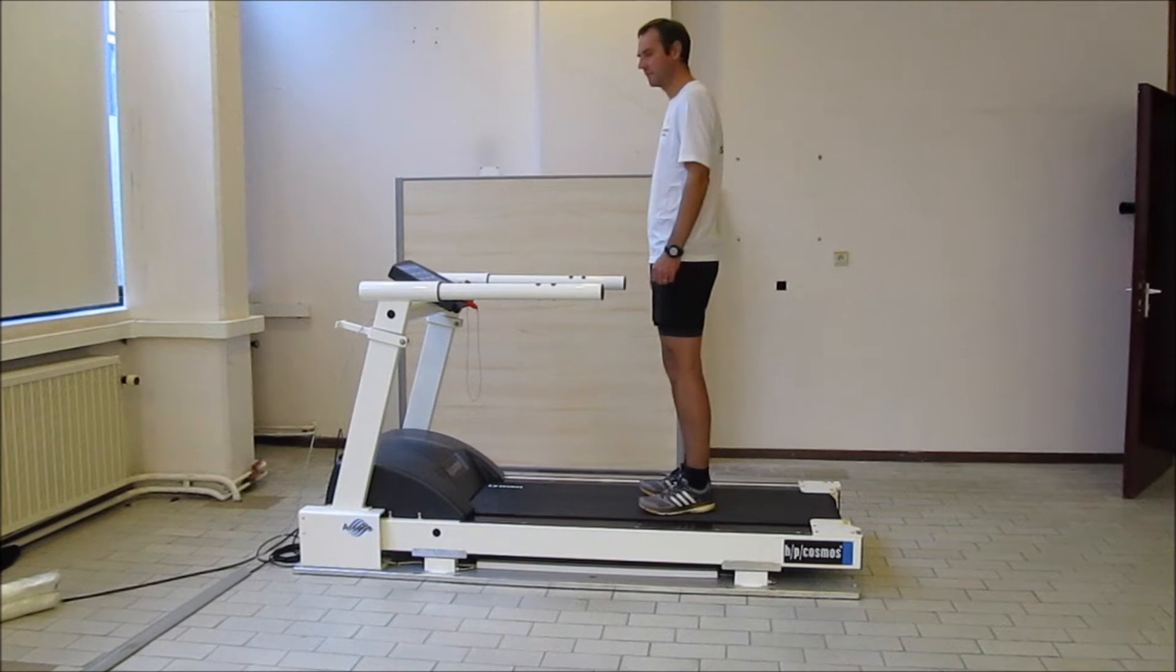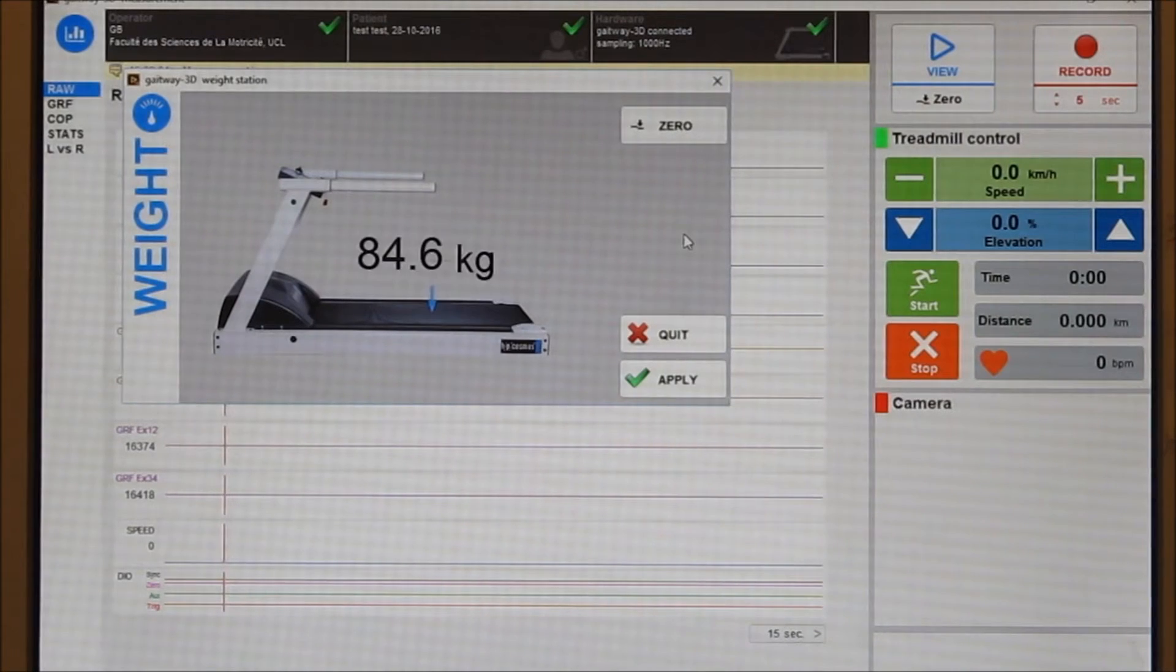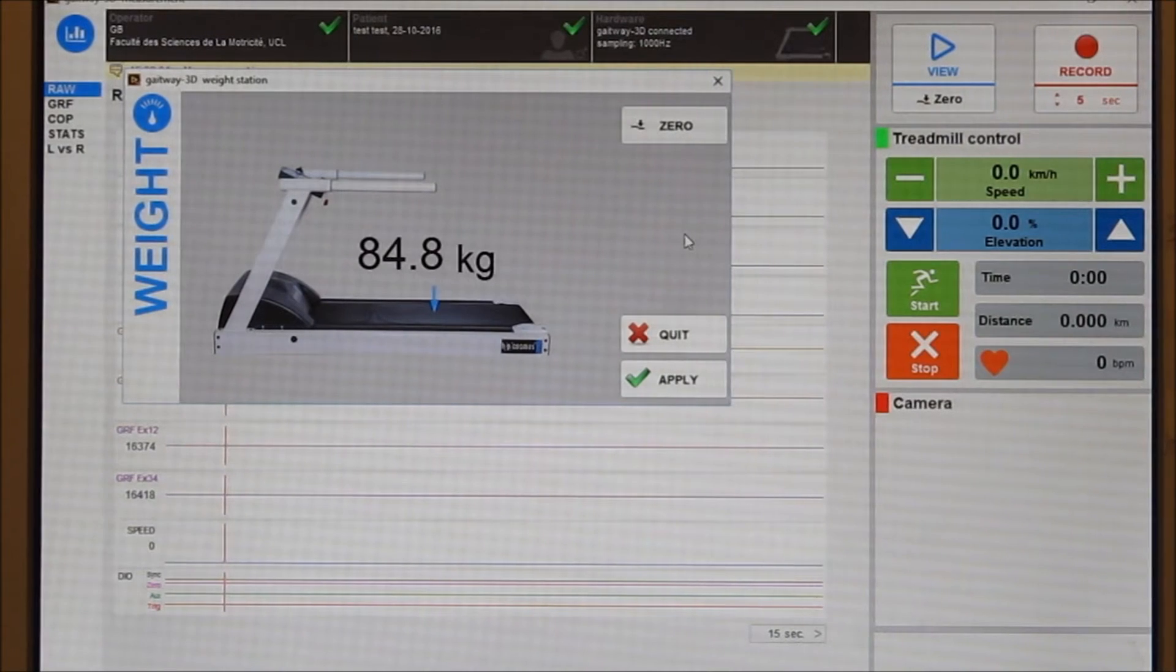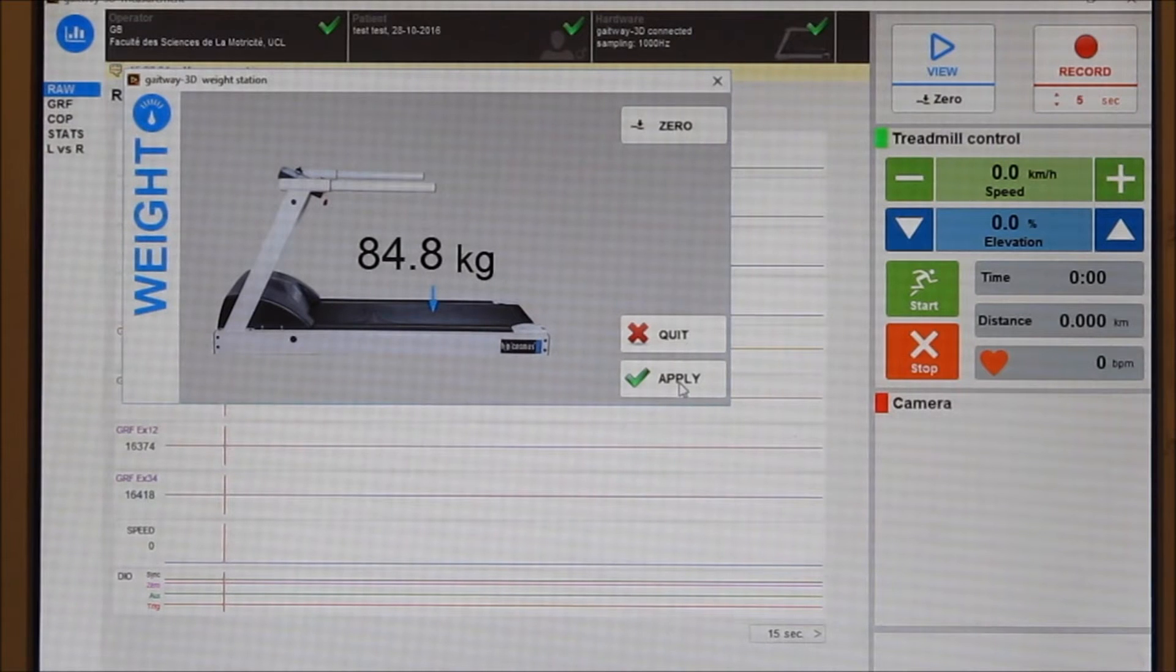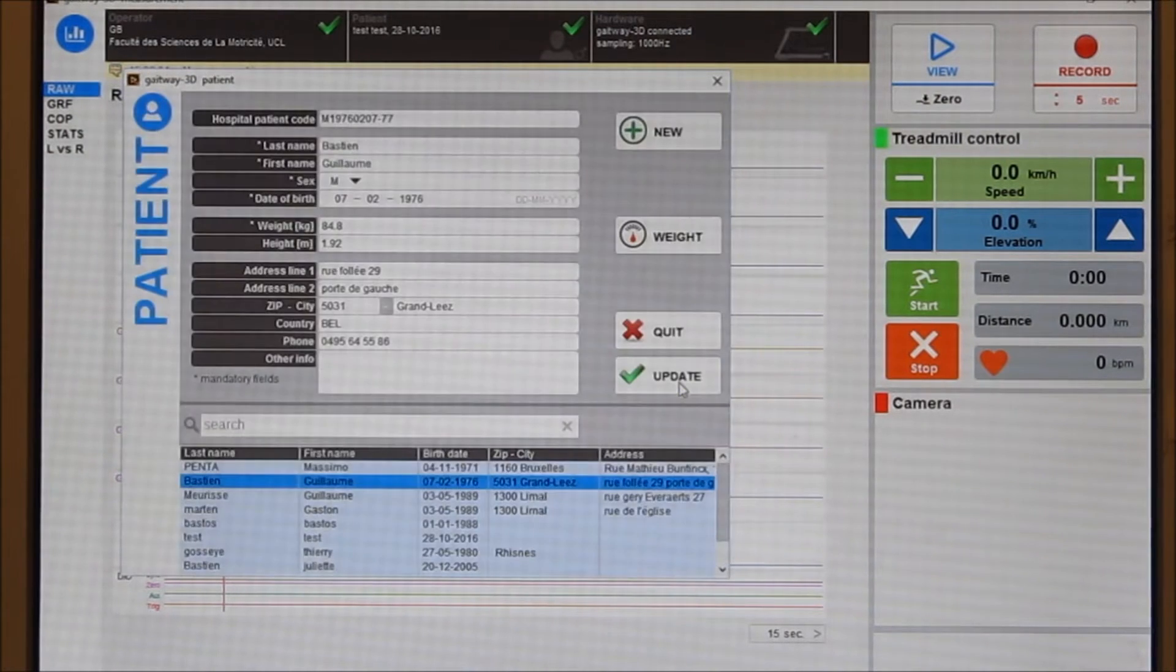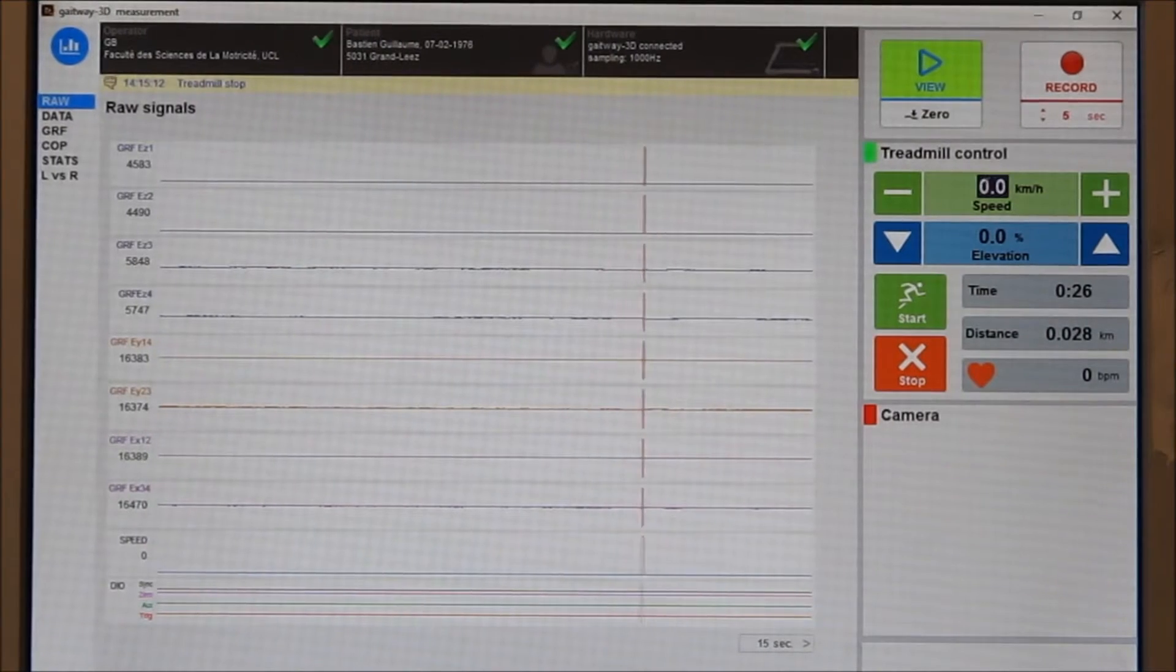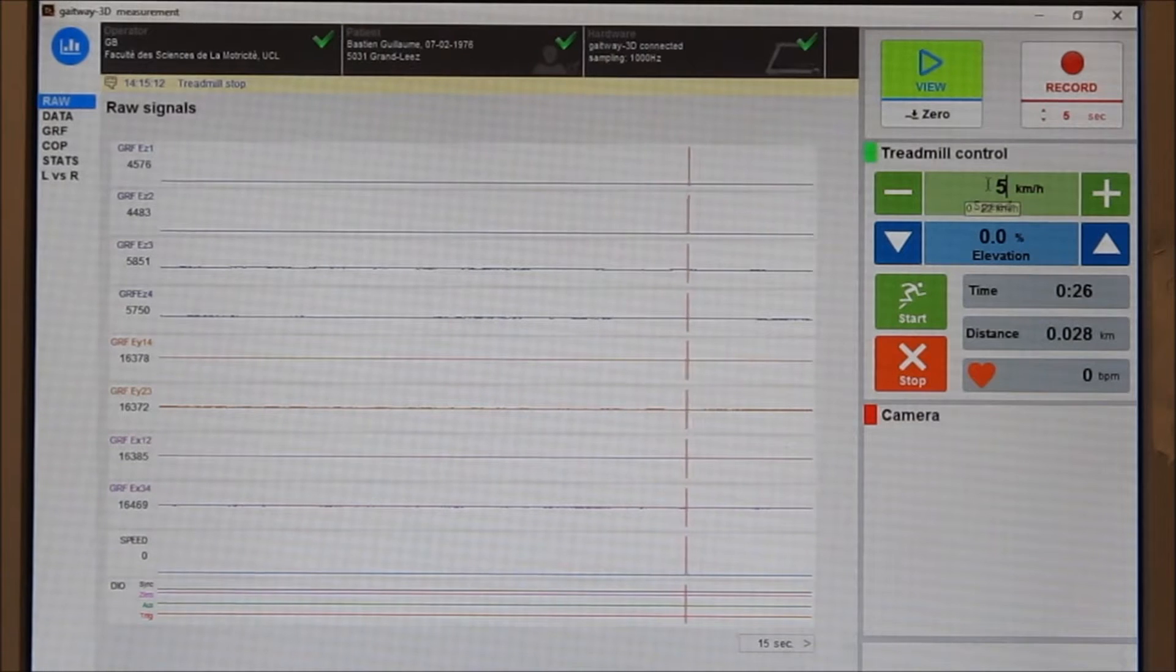We ask the subject to step on the treadmill and stand still. Once the measure is stable, the body weight can be recorded and it will be stored in the database.